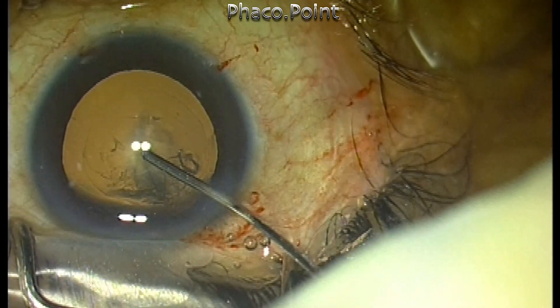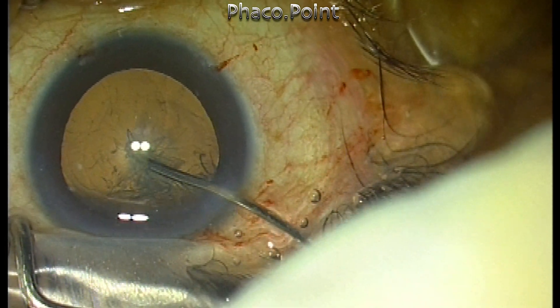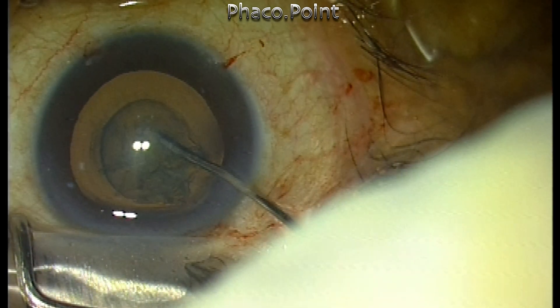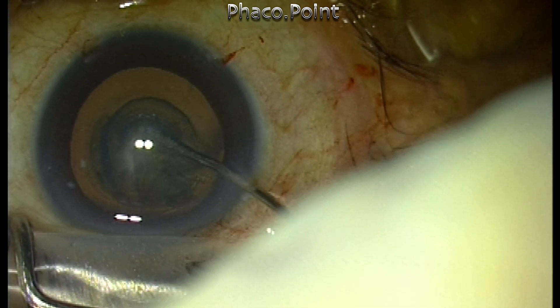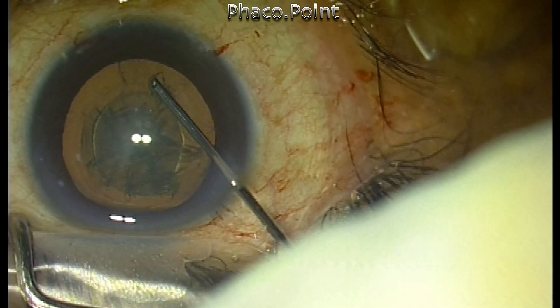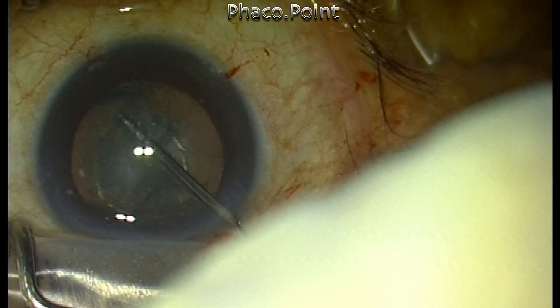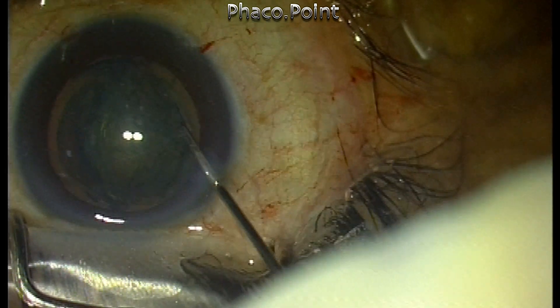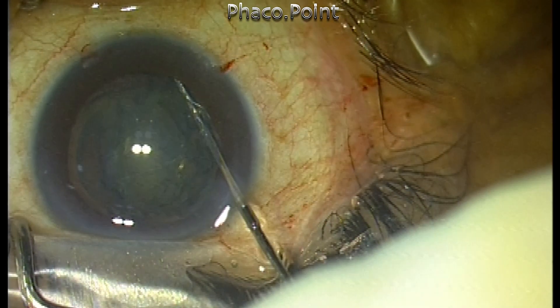Look at this case where multiple lamellae get formed as I inject balanced salt solution in the center. Once you are able to delineate a particular lamella, you can fine-tune it or further define the edge of the endonucleus with a circumferential injection of fluid. So try this combination of techniques — it will help you.